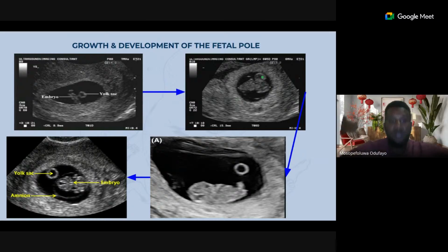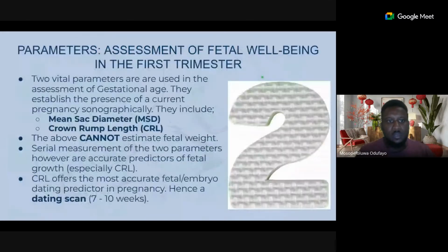Obviously, the first thing we're going to want to check, to see if all of this is even going to lead to a real life baby, is the fetal heart. I had already mentioned that sometimes you can also measure the size of the yolk sac, inner to inner diameter. That's like the earliest pointer to the presence of an abnormality. Is that okay?